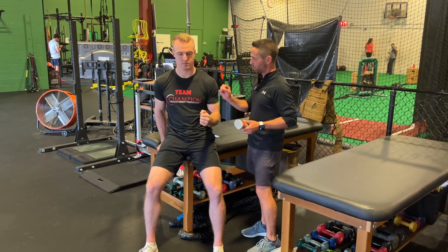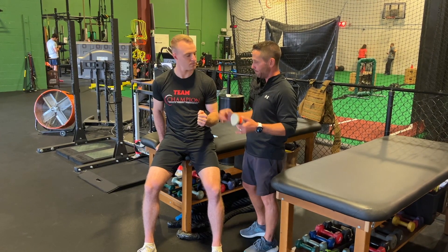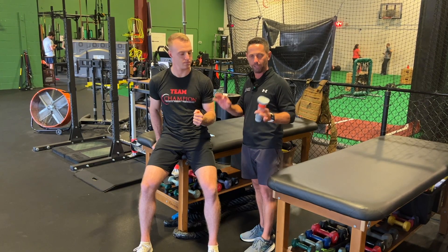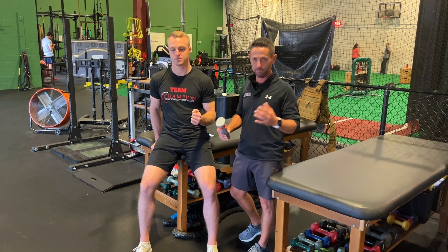I want you to start this rep by easing in, ramp up, push as hard as you can for about five seconds, and then we're going to slowly ramp off. Those are the keys I tend to use with everybody.